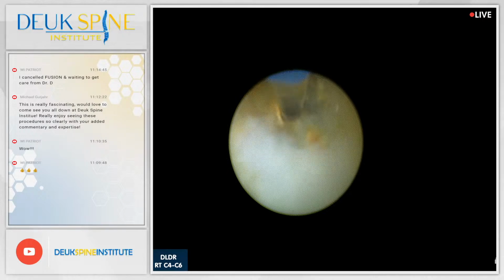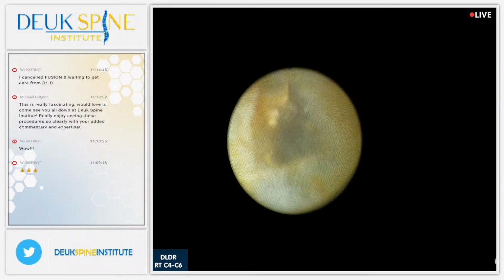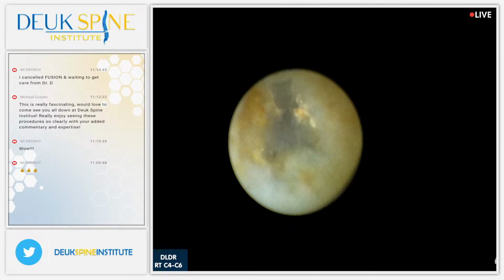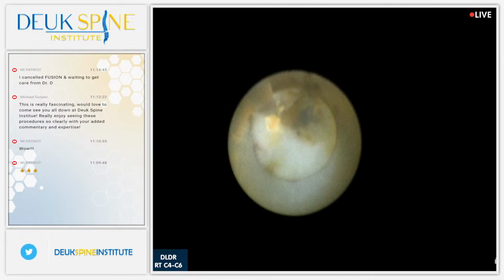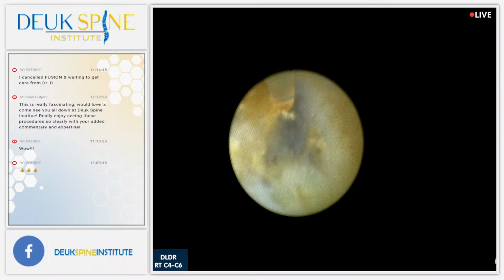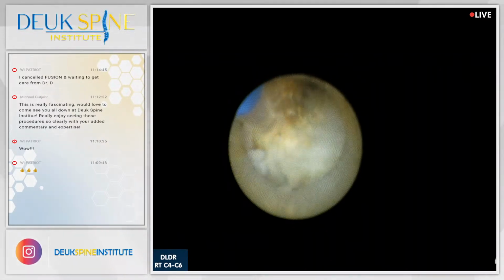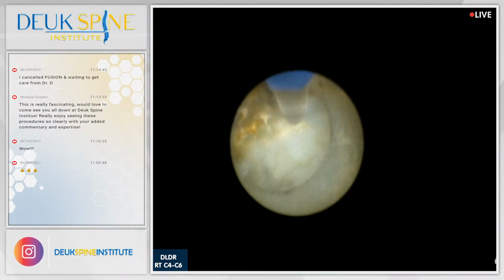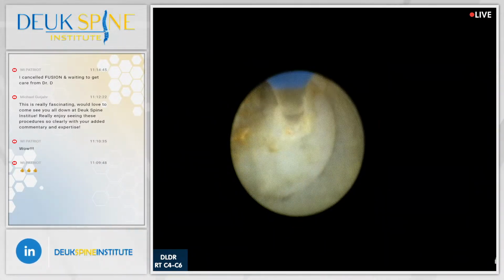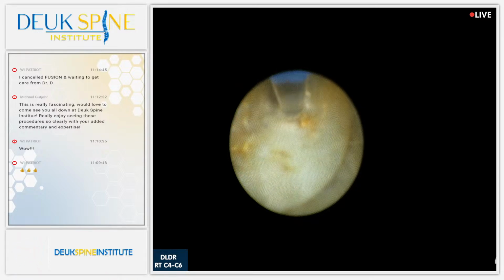Basically it gives us the accurate diagnosis about 98% of the time. The only times it's wrong is when we leave out some stuff because the patient didn't have pain on that day from the other areas that were causing pain. So what I'm saying to you is we now can diagnose the source of pain without a discogram. We don't need it. This is all thick scar tissue as I predicted, and that's why the tear on the discogram I just did was so small, because there's such thick scar tissue that the scar tissue doesn't absorb the dye, it just channels it.